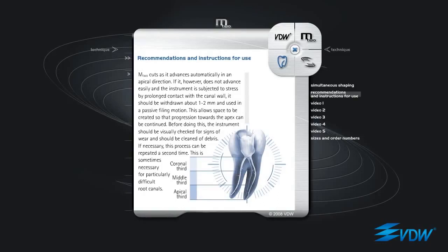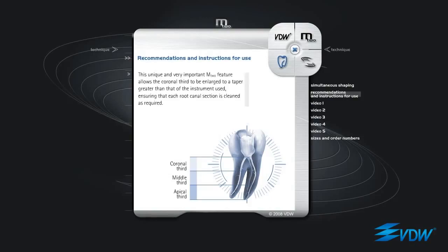If, however, the instrument does not advance easily and is subjected to stress by prolonged contact with the canal wall, it should be withdrawn about 1-2 mm and used in a passive filing motion. This allows space to be created so that progression towards the apex can be continued. Before doing this, the instrument should be visually checked for signs of wear and should be cleaned of debris. If necessary, this process can be repeated a second time. This is sometimes necessary for particularly difficult root canals. This unique and very important M2 feature allows the coronal third to be enlarged to a taper greater than that of the instrument used, ensuring that each root canal section is cleaned as required.